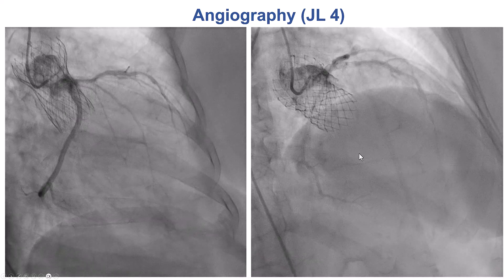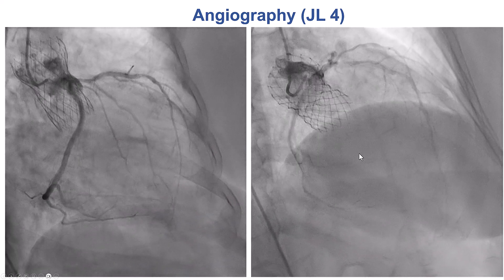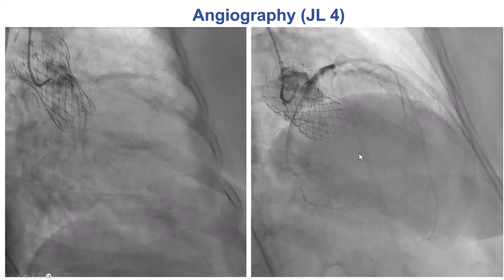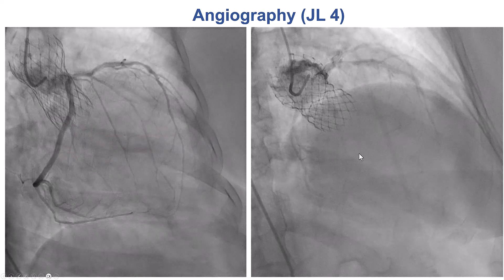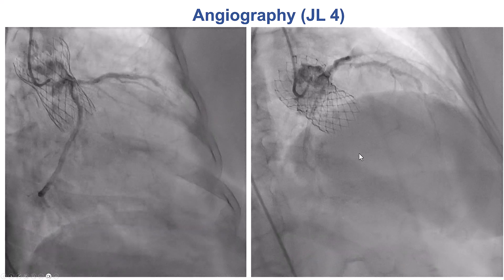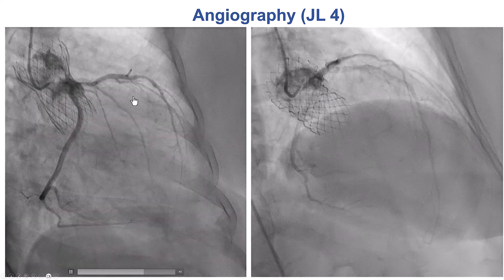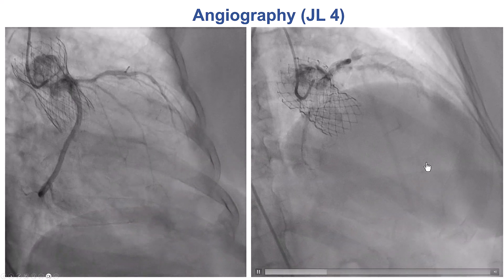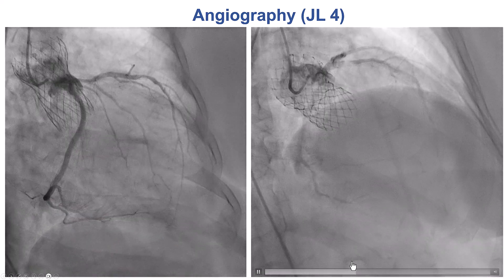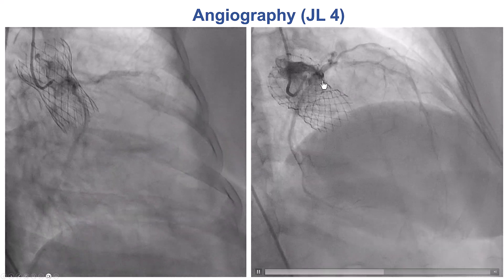This is the coronary angiogram. There was significant difficulty with engaging the left main, and these were the images obtained, based on which a conservative approach was recommended. However, the quality of the images is suboptimal. As we can see on both films, there is poor filling of the coronary artery and poor visualization of the LAD especially. So essentially these are non-diagnostic images, and as we'll see subsequently, there were potential issues that were missed with this angiogram.